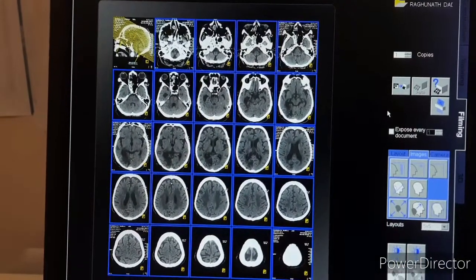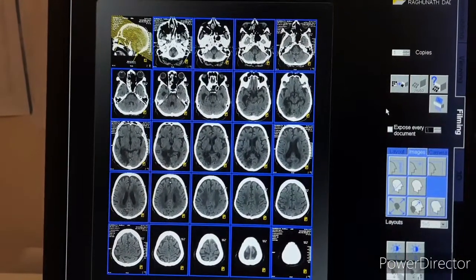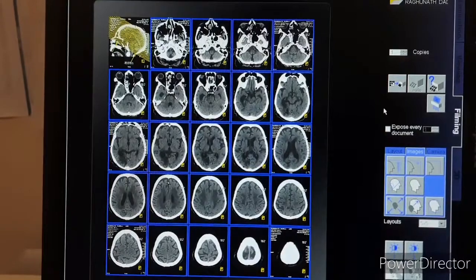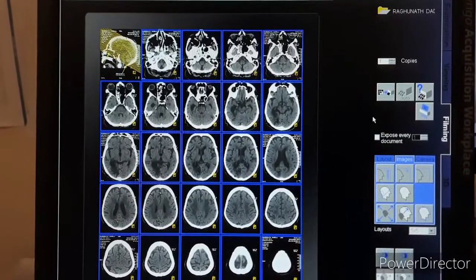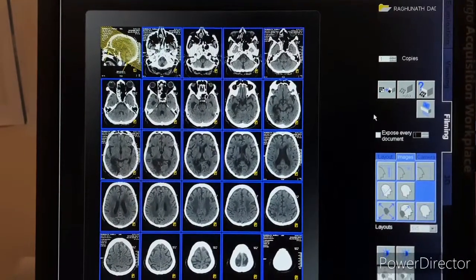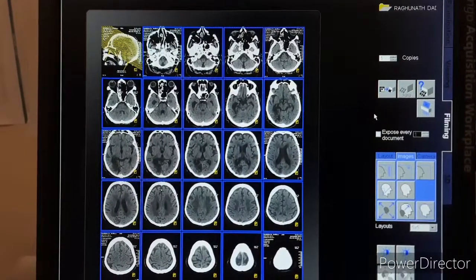Film format for CT brain — format is 5 by 5.